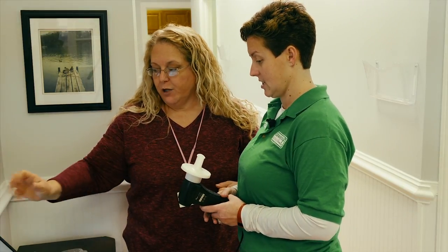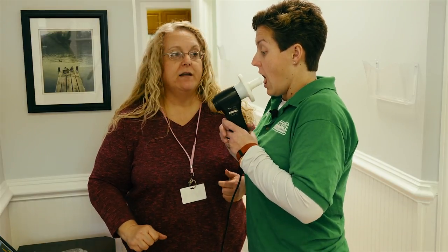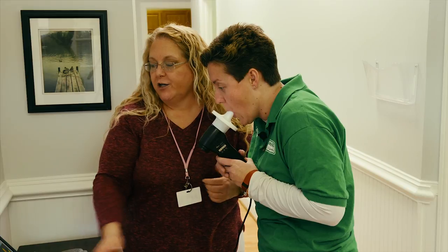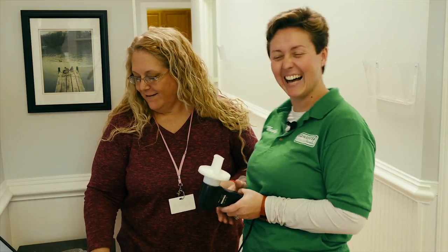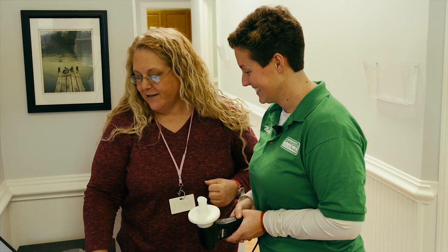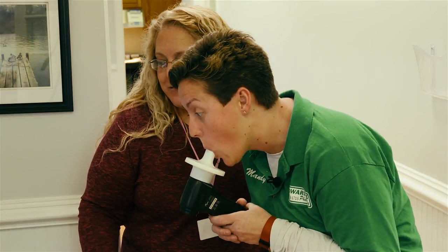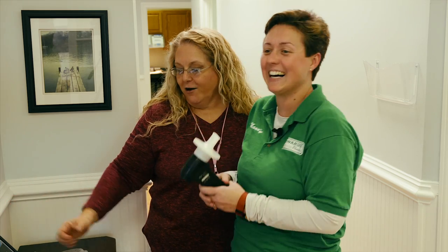And we're going to blow some virtual candles out. Big breath in and blow. Punch it. Push. Good. All right. But you need to work harder. This is an effort-dependent test, so I need you to work super hard. Try again. And blow. Punch it. Push. All right. You got all the candles out.